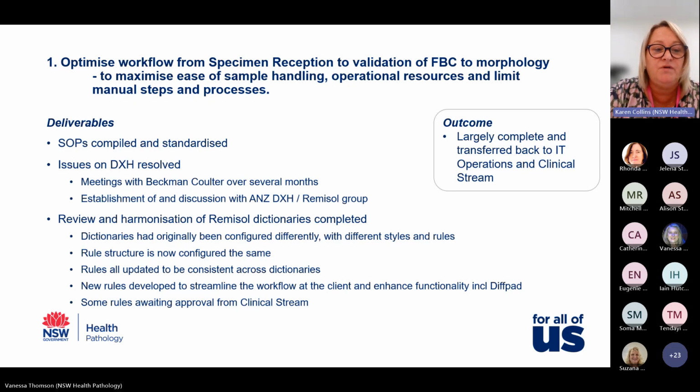We also reviewed and harmonised the Remisol dictionaries, which Vanessa spoke about before. So originally they'd all been configured differently with different styles and rules. I think all the IT departments had their training with Remisol, and then they went back and implemented in the best way that they could. And so now the rule structures are all configured the same. They're all named the same way in all the different operational areas, and they're updated to be consistent across the dictionaries.